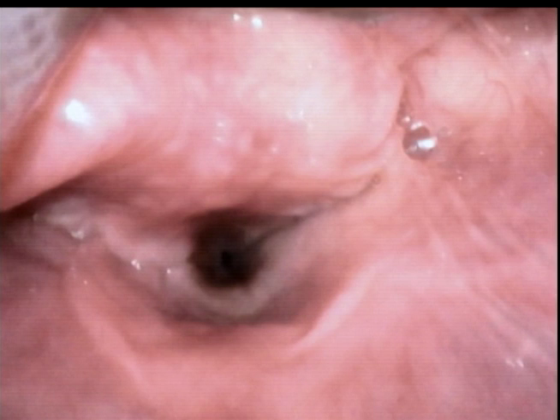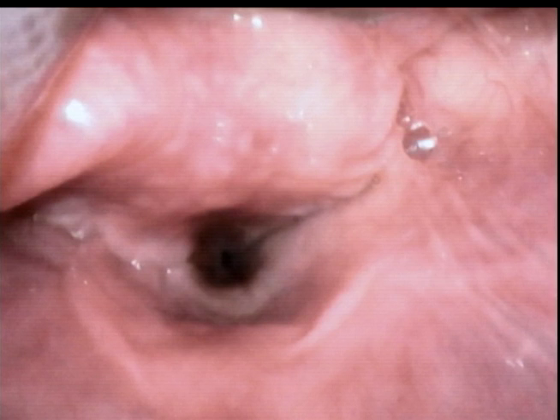It is not uncommon for the novice laryngoscopist to place the laryngoscope too deeply into the airway so that critical anatomy is bypassed. In this case, the laryngoscopist who may believe they are looking at the larynx is actually looking at the esophagus.